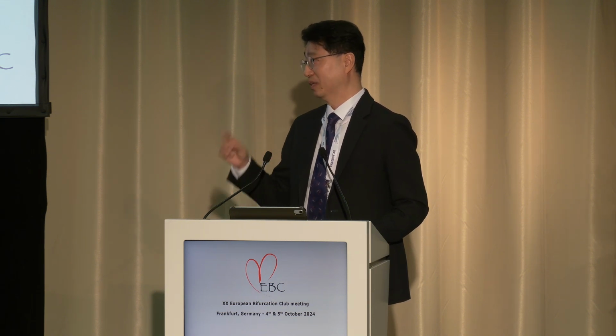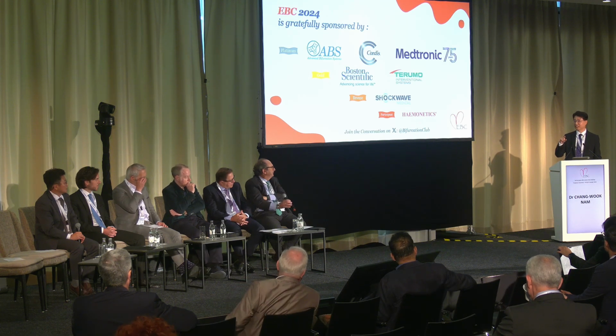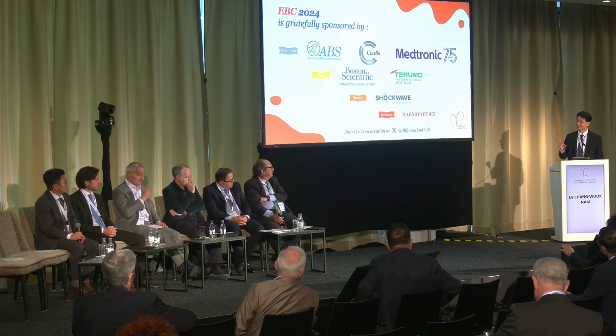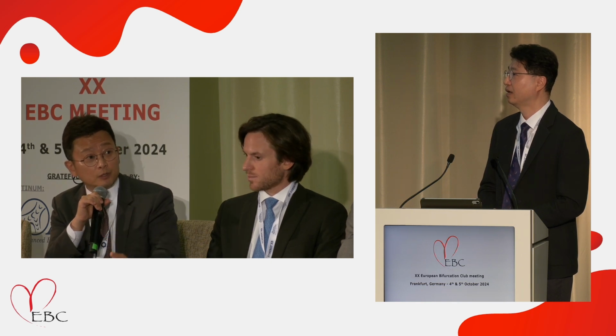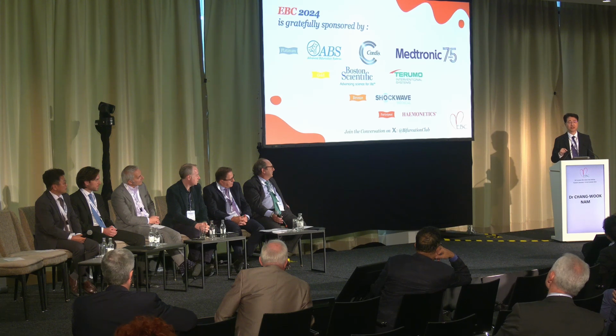And then also, the second point is, even though we believe that it's an angiographic 001 lesion, the reality is not a 001 lesion. Reality is more complex, like a true bifurcation lesion, even though angiographic 001. Do you recommend more use of intravascular imaging? Sure. Yes, actually, if you want to treat with a stent in a 001 lesion, I think we have to use intravascular imaging before the procedural strategy decision making.